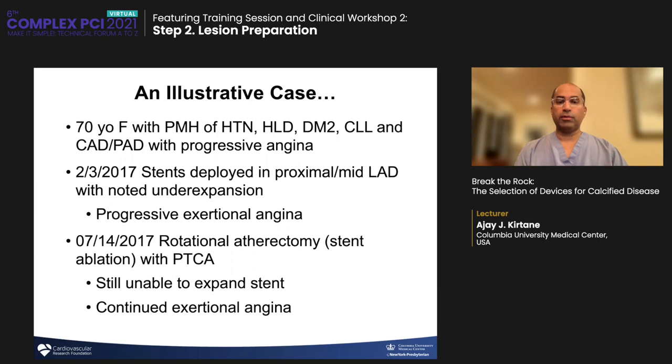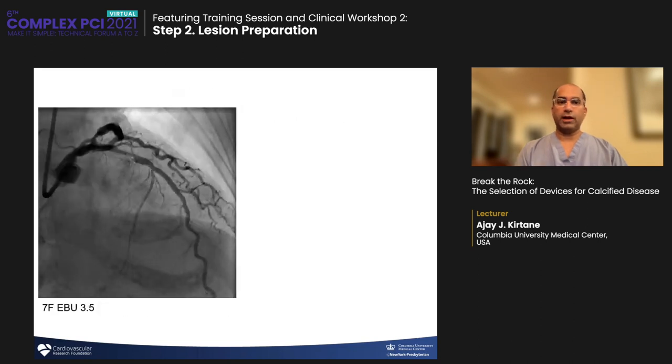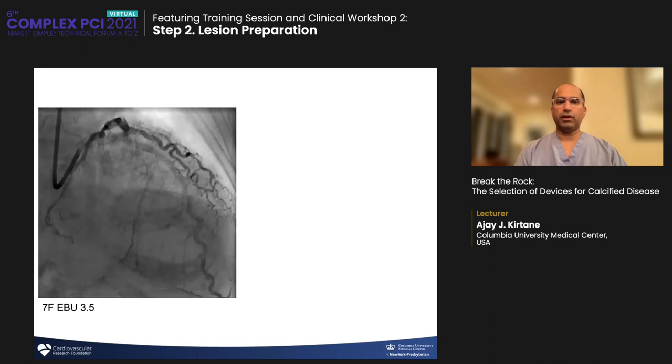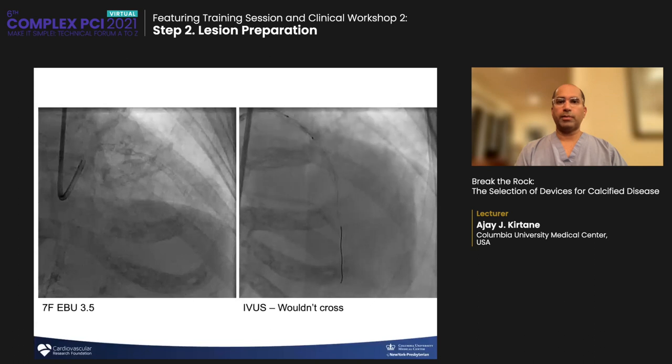Another operator actually performed rotational atherectomy with stent ablation to try to ablate the stent and the calcium behind it, with then angioplasty alone, but was still unable to expand the stent, and the patient continued to have symptoms. She then returned back a third time, and this is what she had in her proximal LAD. You can see it's unfortunate because the remainder of the vessels appear to be quite large and unobstructed, but in that proximal LAD segment, an IVUS catheter won't even cross because of how underexpanded the stents are with residual calcium that's there. This has already been ablated with rotablation.